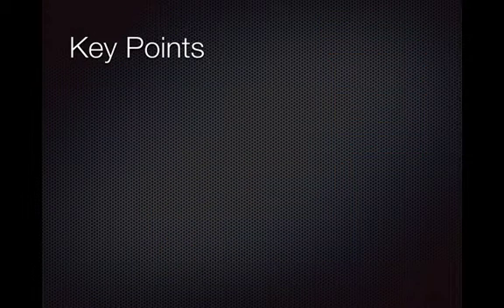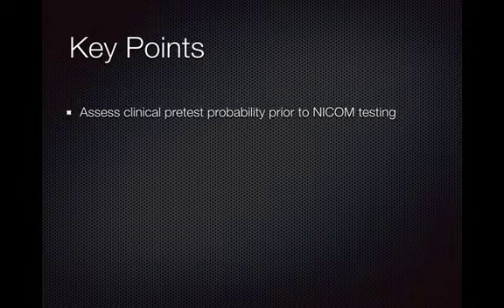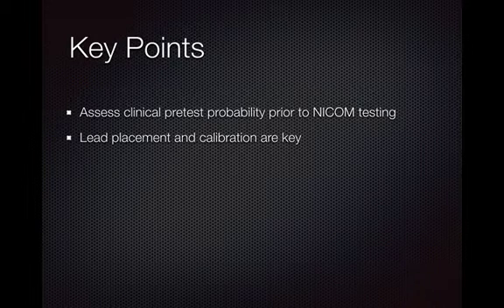Okay, let's wrap up with some key points. First, we need to assess the clinician's pretest probability of whether patients are fluid responsive. This is important because we're studying whether ultrasound can predict fluid responsiveness, as well as whether it can improve the clinician's ability to predict fluid responsiveness. So we need to get the clinician's assessment prior to the NICOM as well as the ultrasound. Lead placement on clean, dry skin as well as the calibration process are key. Remember that you need 3 minutes of the patient holding still for the calibration.